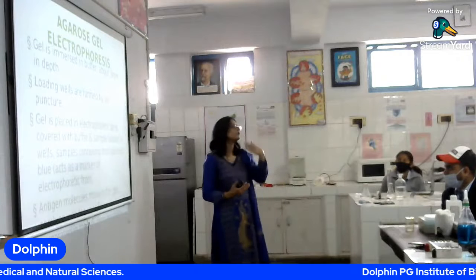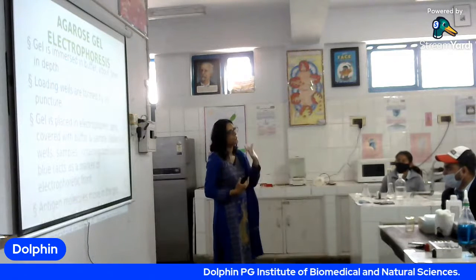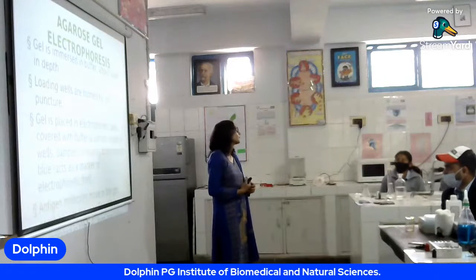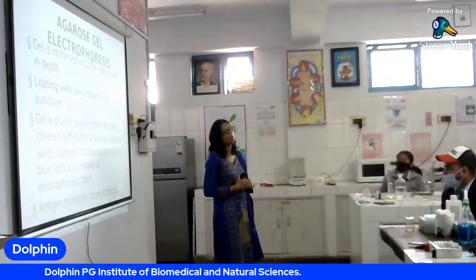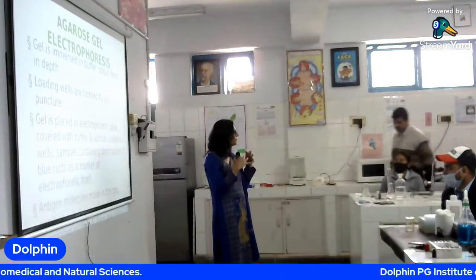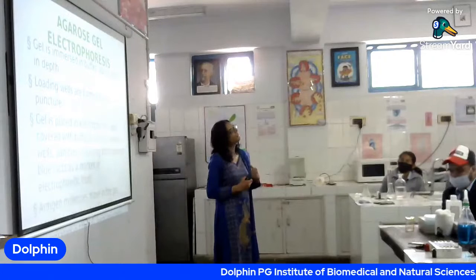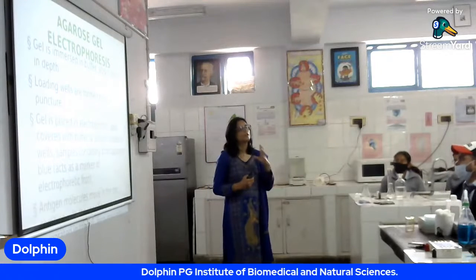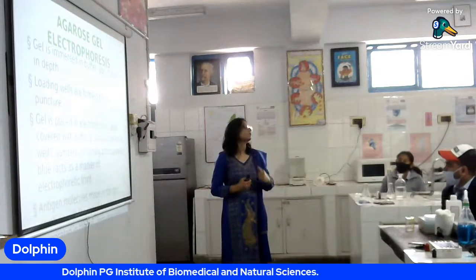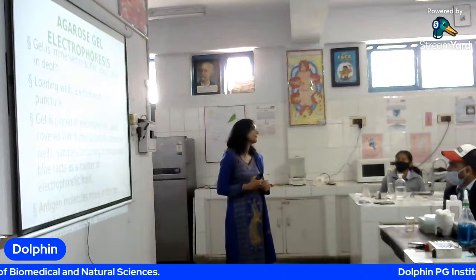Now the antigen will move and find its antibody. Antigen चलेगा, जल्दी जल्दी क्या करेगा? Antibody को ढूंढेगा. जहां से एंटीबॉडी मिल गई वहां क्या होगा? ये देखिए binding, a specific binding between the antigen and the antibody. Okay, so when there is binding, वो binding हमको देखनी है. So that binding will be seen in the form of bands.